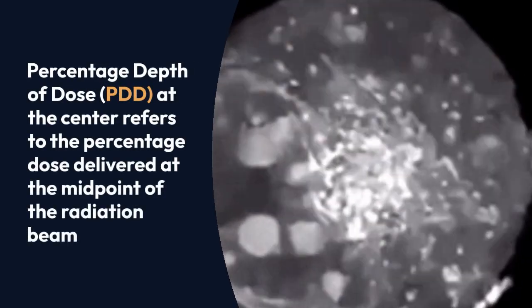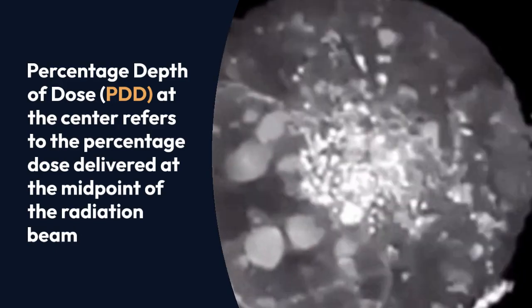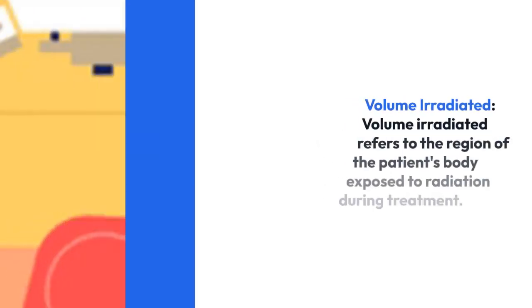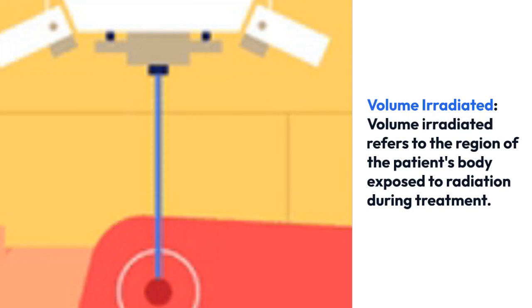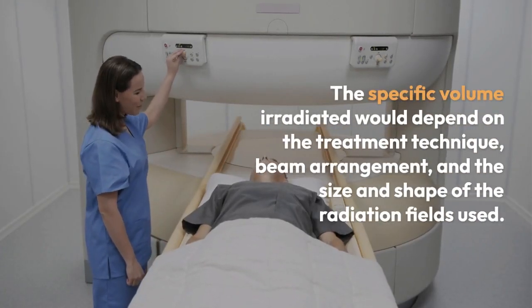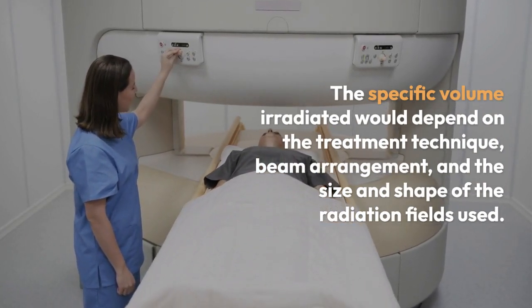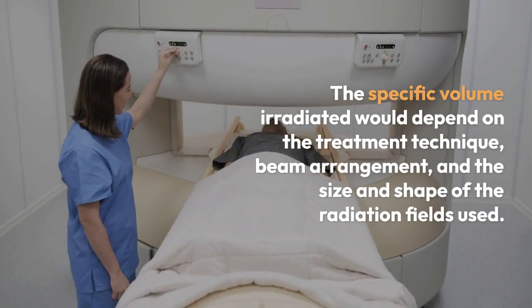Percentage depth of dose at the center refers to the percentage dose delivered at the midpoint of the radiation beam. Volume irradiated refers to the region of the patient's body exposed to radiation during treatment. The specific volume irradiated would depend on the treatment technique, beam arrangement, and the size and shape of the radiation fields used.